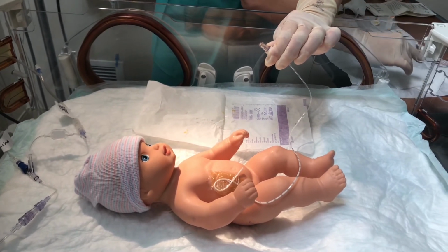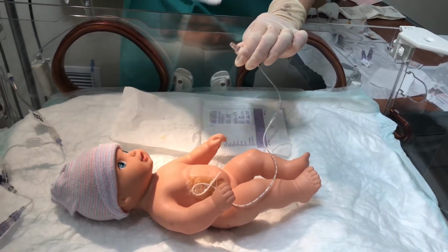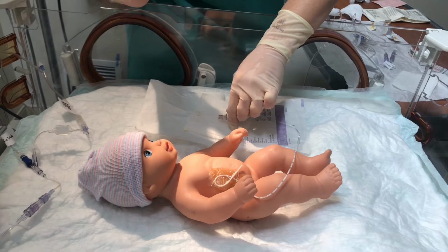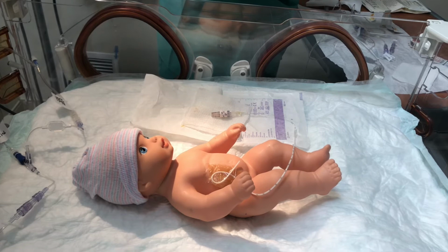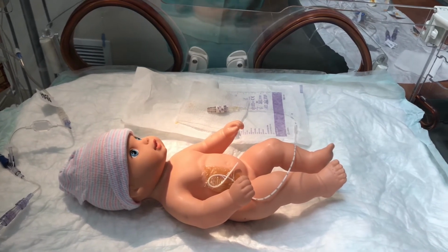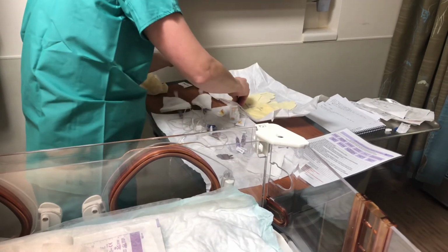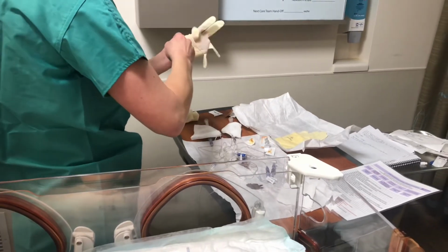At this time, we're going to grasp our last sterile 4x4, and we're going to invert it, and we're going to place it under that scrubbed clave that you can place down at this time. At this time, we're going to don our new sterile gloves, so that we can connect our new tubing to our clave.